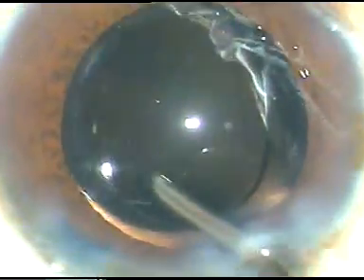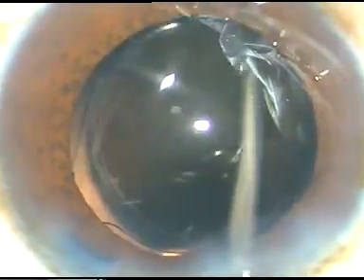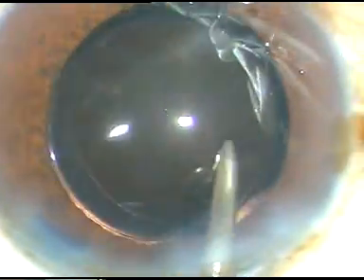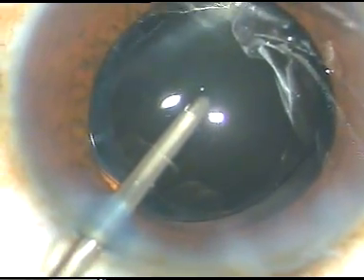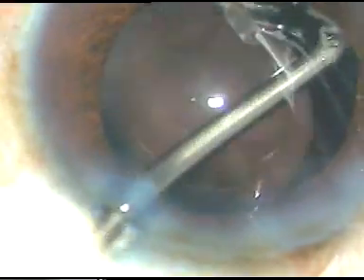The lens is not rotating very freely, so there is something wrong. The leading haptic has not gone into the capsular bag. So what I do is I put the irrigation on. The Sienzki hook and the irrigation probe both are used to place the leading haptic into the capsular bag.